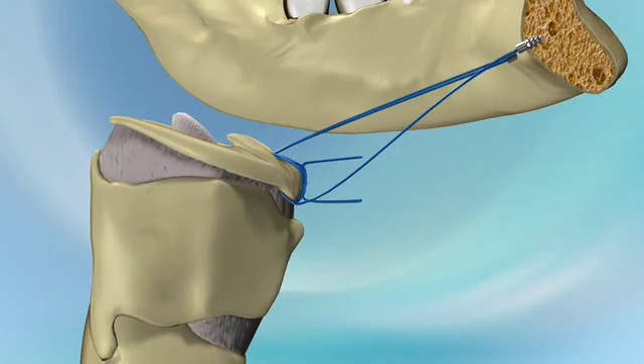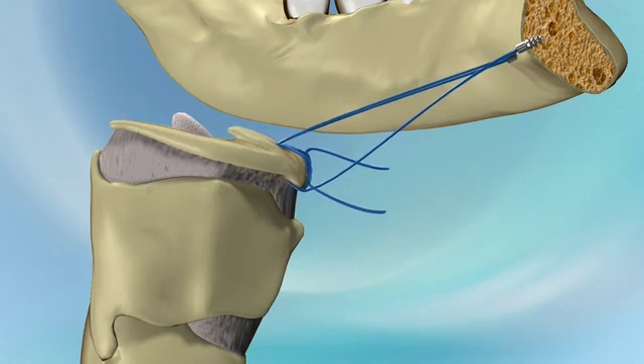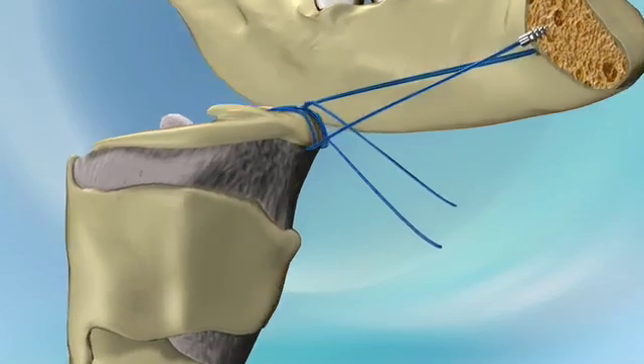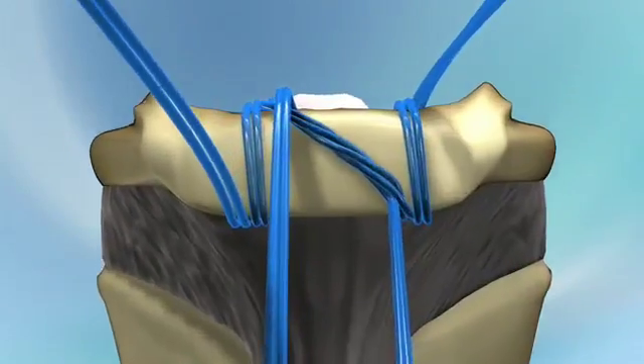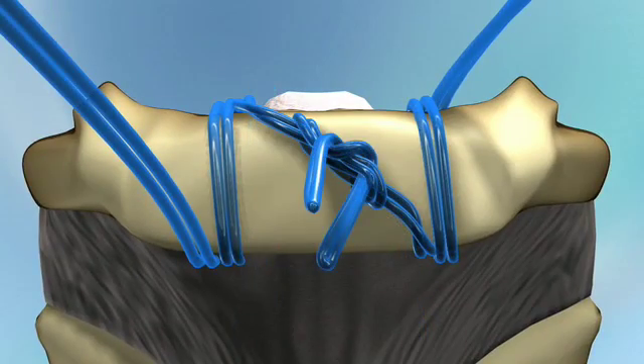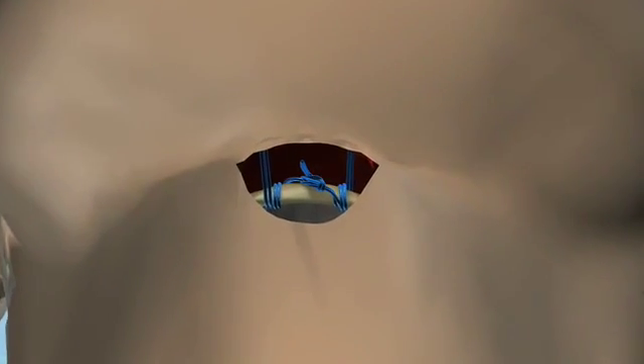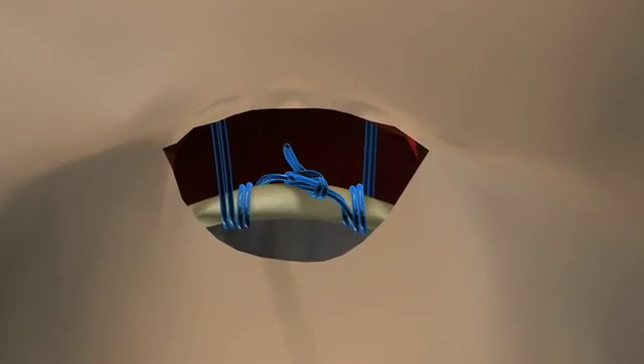As the tails are pulled in opposing directions, the previously placed hyoid suture loops behave like a series of pulleys, easily drawing the hyoid up toward the mandible approximately 8 to 10 millimeters, until the inferior midline muscles become drum-tight. Once satisfied with the suspension, a single knot is thrown over the surgeon's knot, effectively locking the suspension. Several half-hitch reversing knots are added to the original knots.